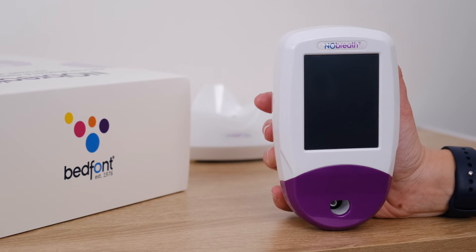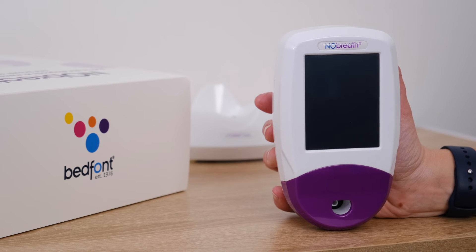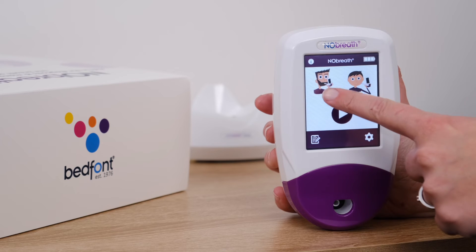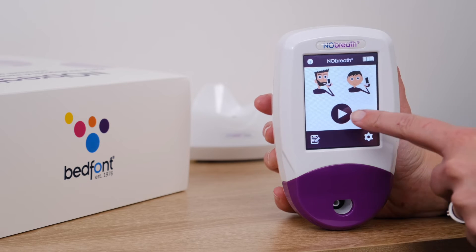Congratulations, the No-Breath setup is complete. Let's take a look at the options available. When you turn on the monitor, you will have three options on the home screen: adult breath test, child breath test, and a demonstration mode.